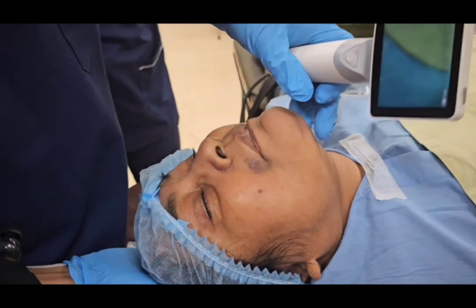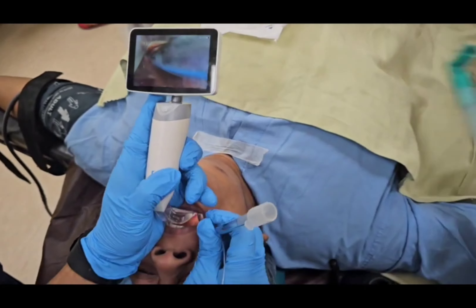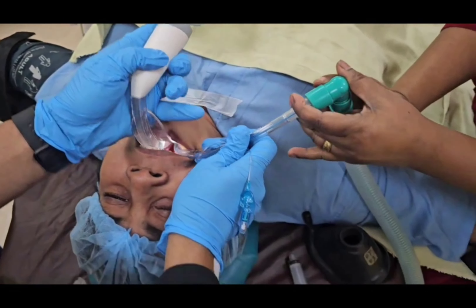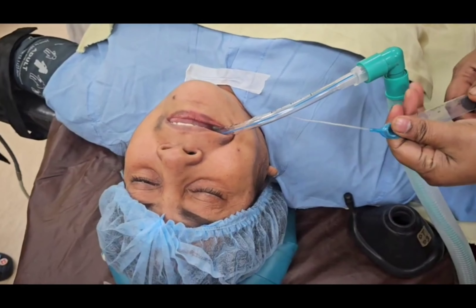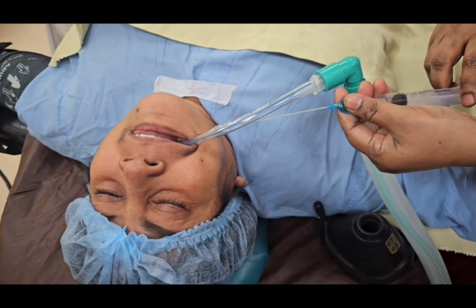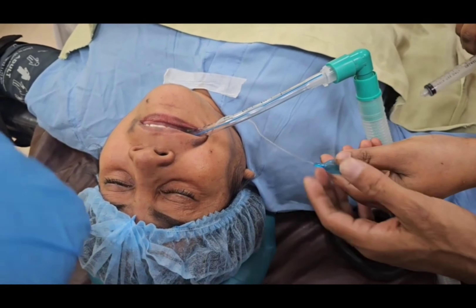Now we are introducing the oxygen and other gaseous lines are fixed. Here we did the intubation with video laryngoscope because it was Mallampati grade 3.